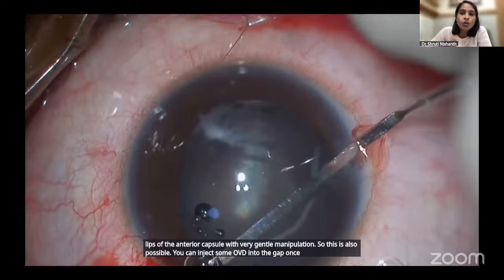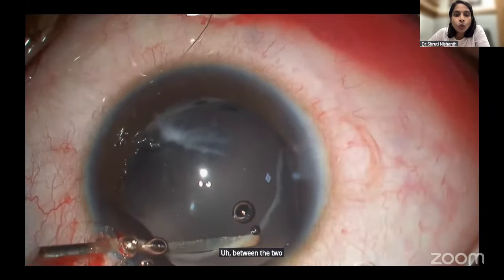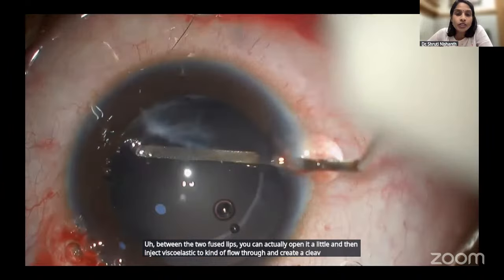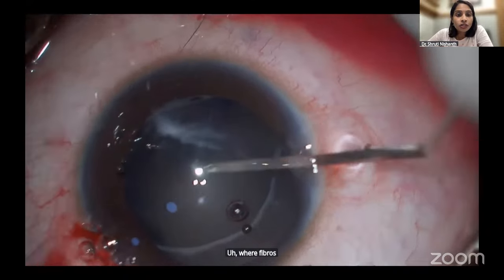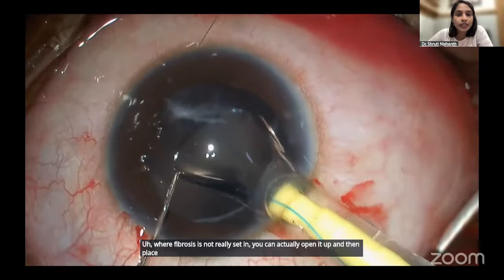Once you get a small gap between the two fused lips, you can actually open it a little and then inject viscoelastic to flow through and create a cleavage plane as well. So here you see a gentle nudging, and then you can open up, especially in the early cases where fibrosis is not really set in, you can open it up and then place the IOL again.